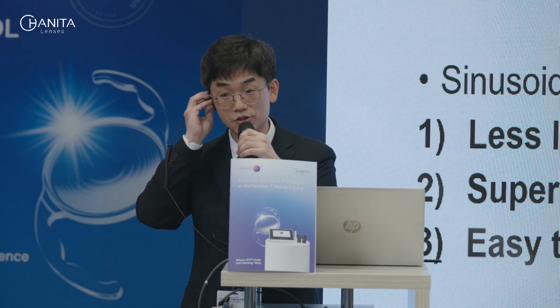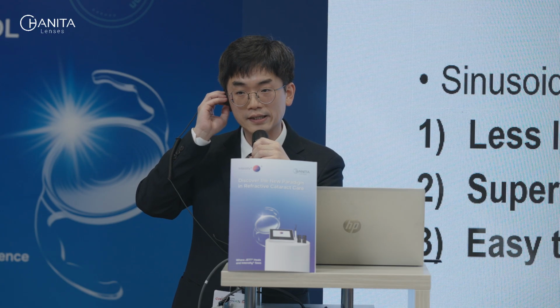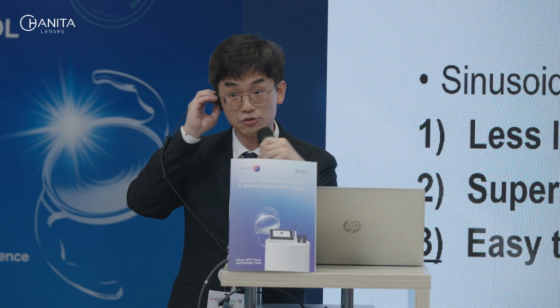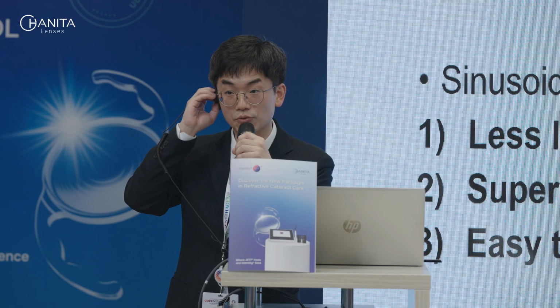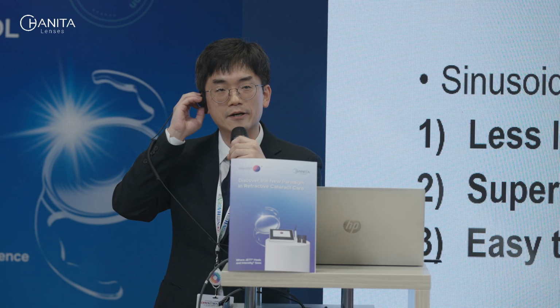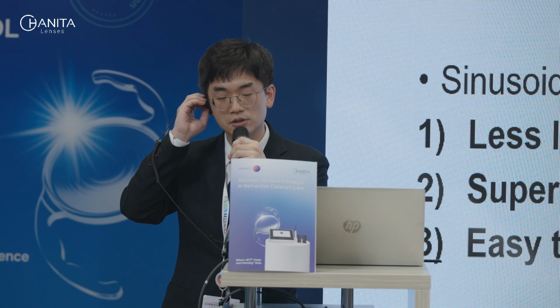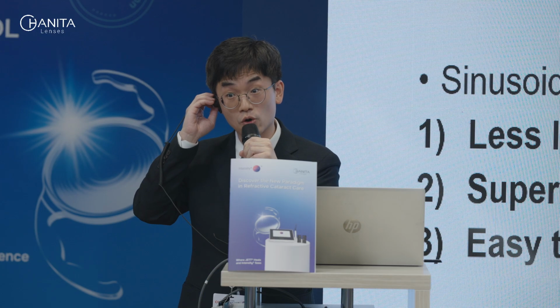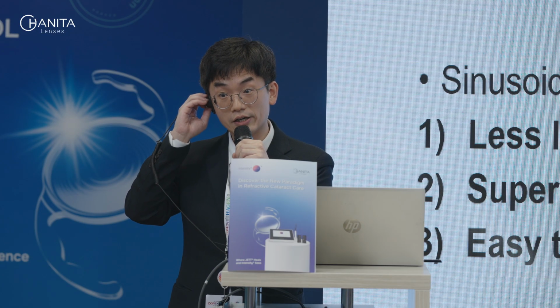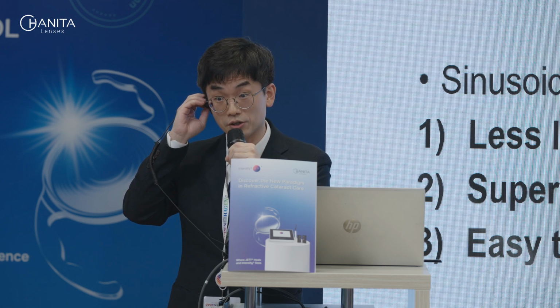Thank you for a very good question. Especially with this design, there is a kind of trend, as you can see over here, the myopic shift by a certain amount. With other designs, let's say Panoptix or other multifocal designs, usually they use a zero diffraction order, which means if you use the IR light source with the same device, it all goes to the zero diffraction order again.